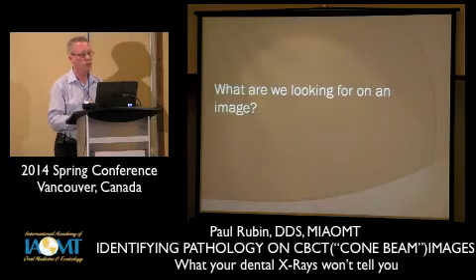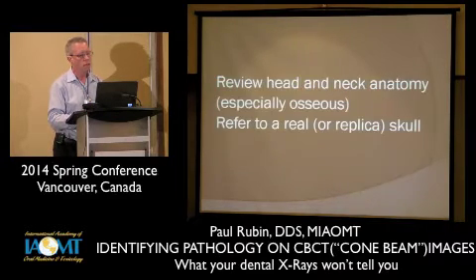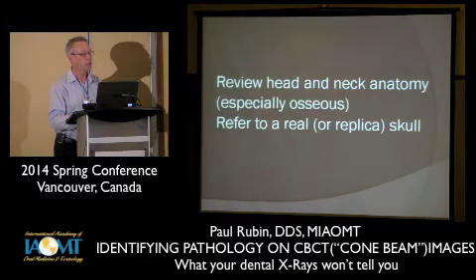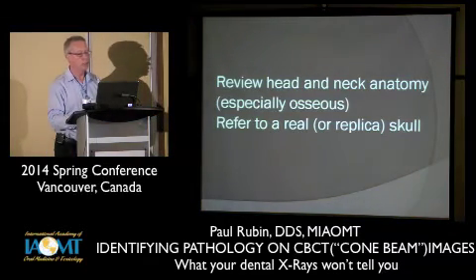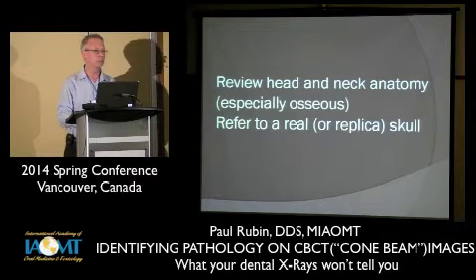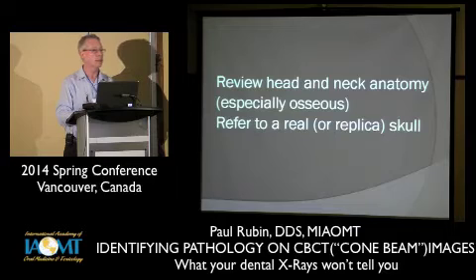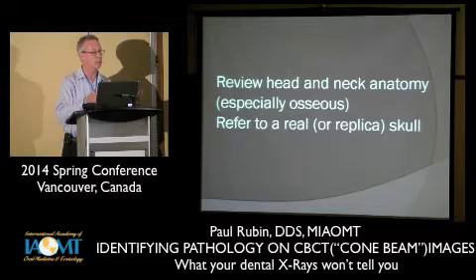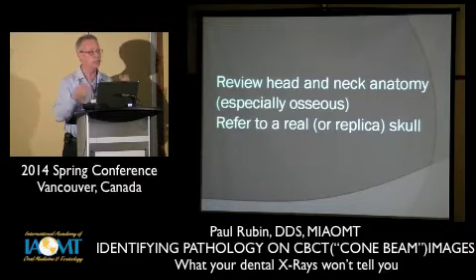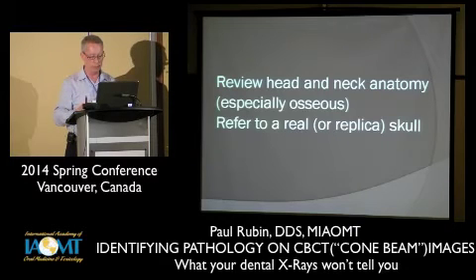So what are we looking for on an image? It really helps to review head and neck anatomy, especially osseous anatomy. It also helps if you have a skull from back in dental school days or a replica skull. It helped me to have a skull side by side with images that I was looking at and get a sense of where this really is on a 3-dimensional skull. It just helped embed the information better in my brain.